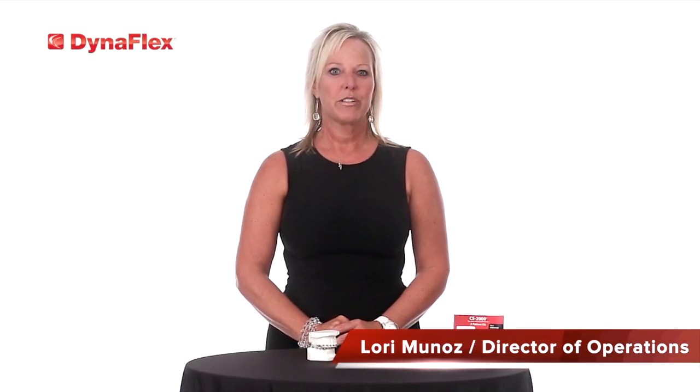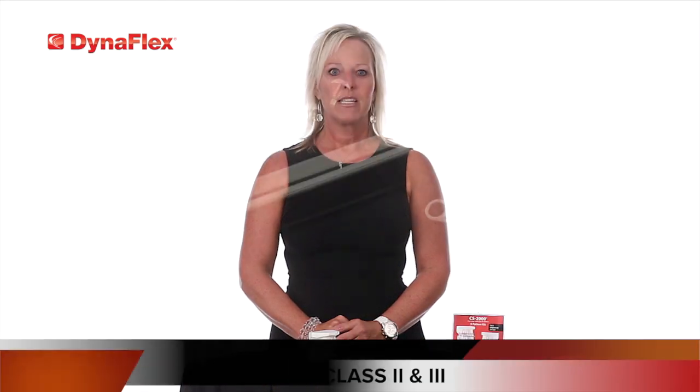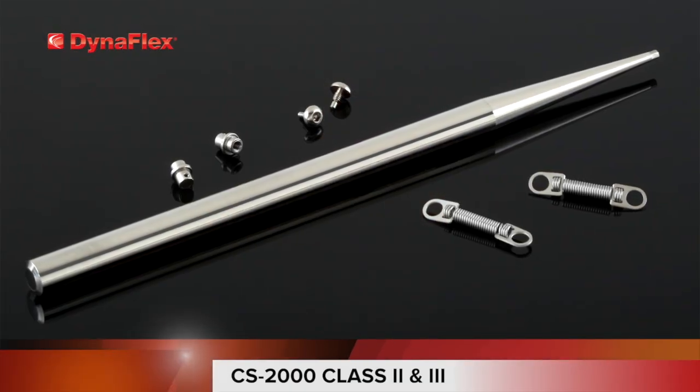Hello, I'm Lori Munoz, Director of Operations for DynaFlex. Today I'm going to discuss with you the CS2000 class 2 and 3 corrector and the easiest way to place the system in the mouth.